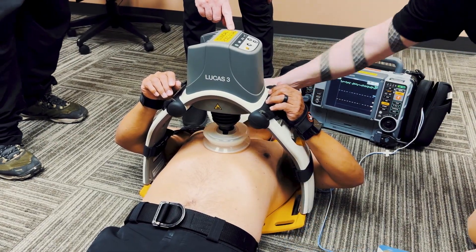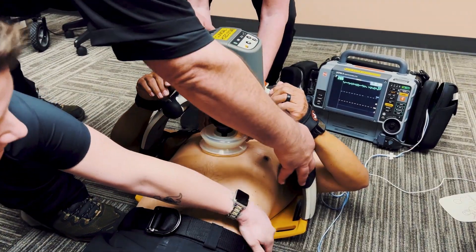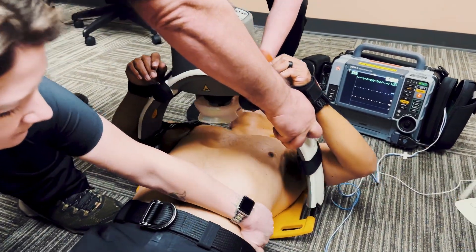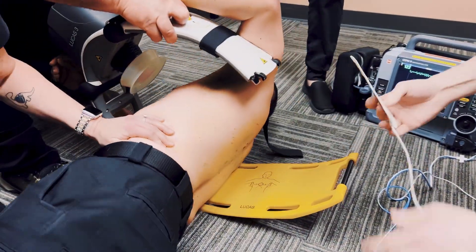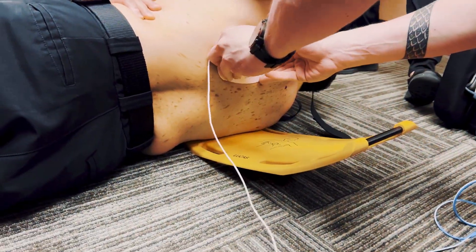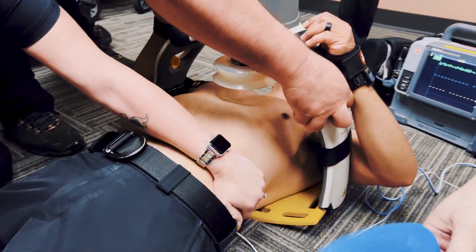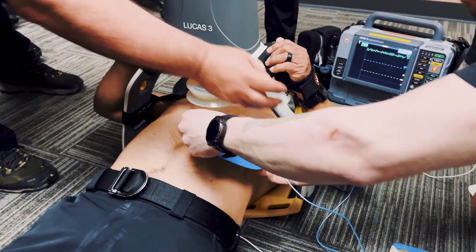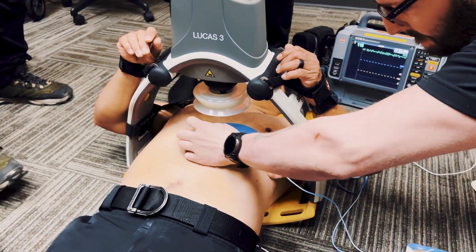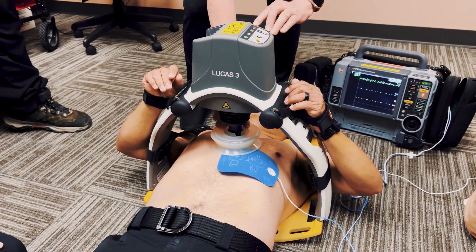Once the pads are in place, continue with compressions immediately. There is no need to pause or verify the rhythm until the next scheduled rhythm check. With good communication, the vector change can be performed with minimal disruption to your overall cardiac arrest management.